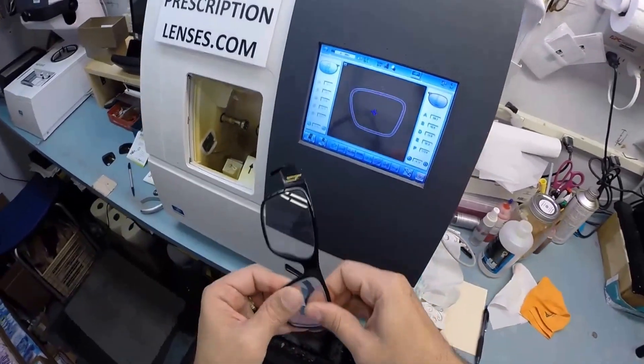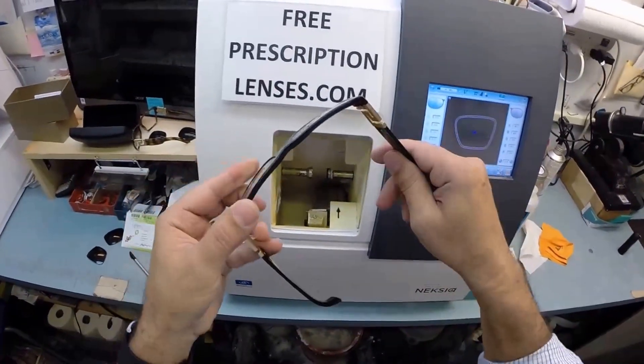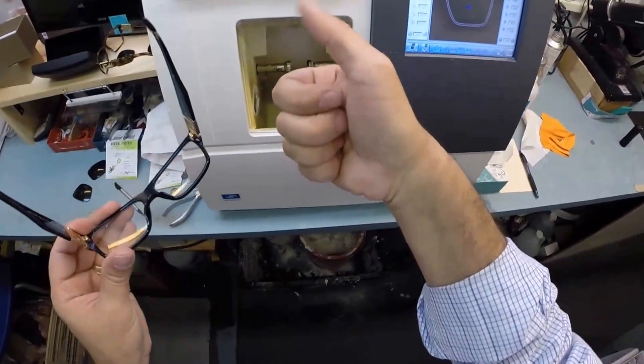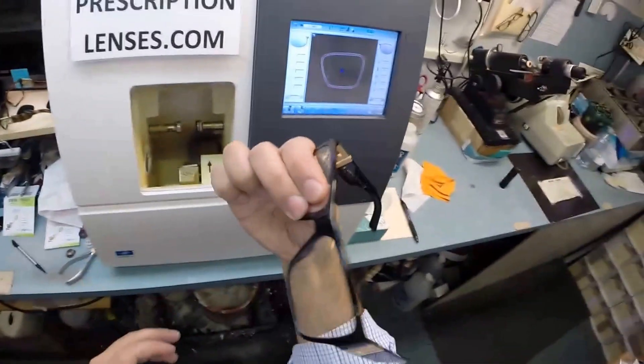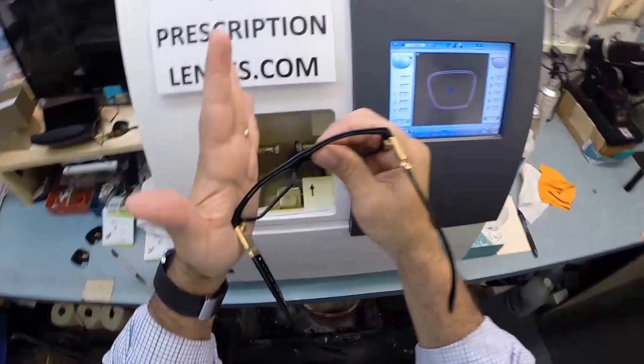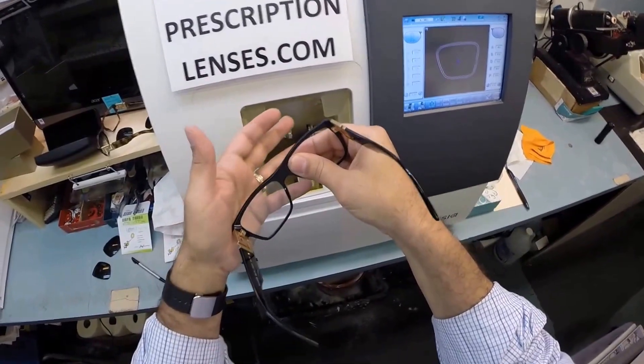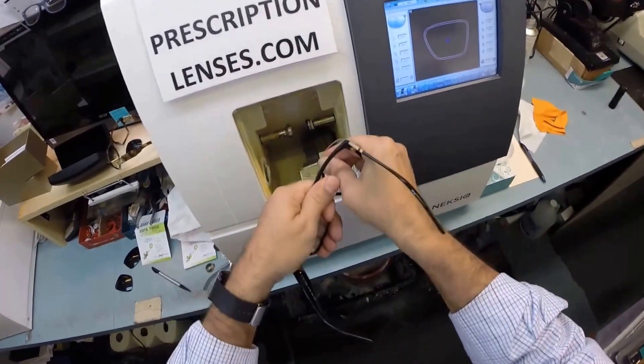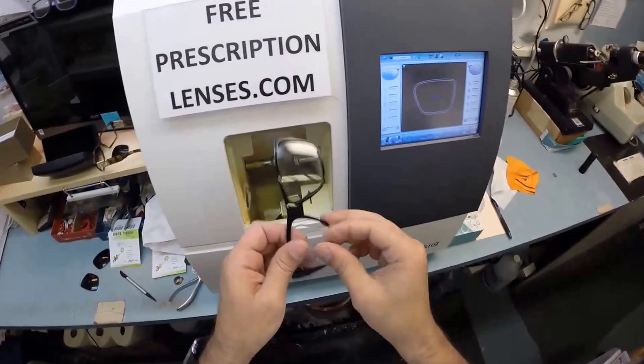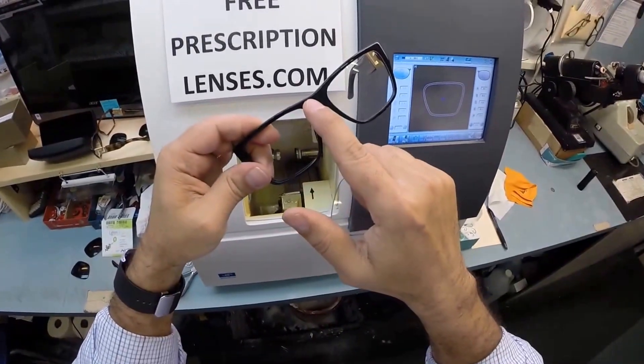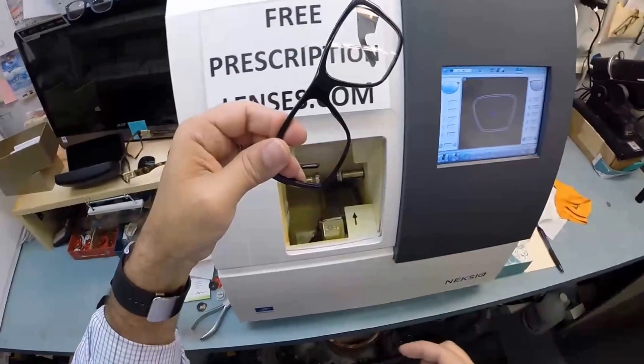If you're ever to take the lenses out, I'll slow it down. To take the original lenses out if you want to wear contacts or put the original sunglass lenses back in, just turn the frame over. You always press down with your thumb at the nose. Press at the nasal portion of the lens, put your fingers on the other side so it doesn't fall on the floor. You can actually torque the frame a little bit—you're not going to hurt it. This is how you mount every lens into a plastic frame. You're going to push down with your thumb. I place one thumb on top of the other and push down. Out comes your lens. The reason why I push there, instead of pulling on the frame elsewhere—this is the thickest portion of the frame, so you never have to worry about breaking it.